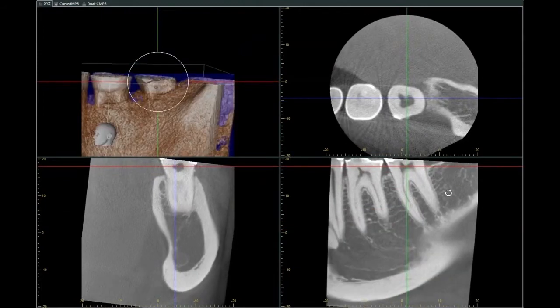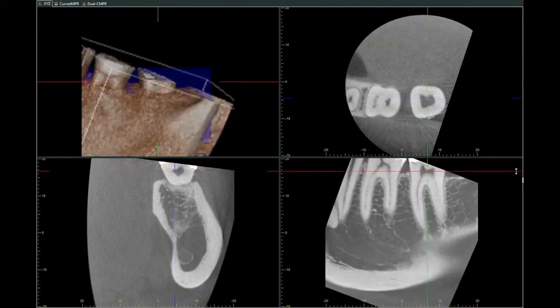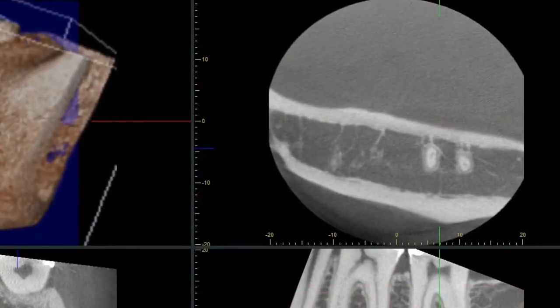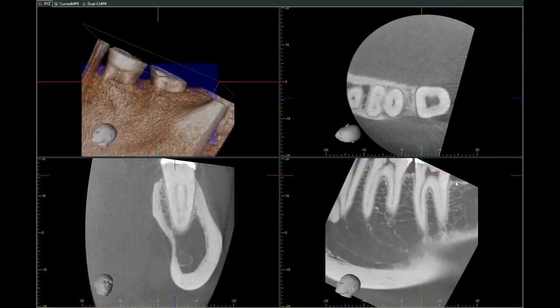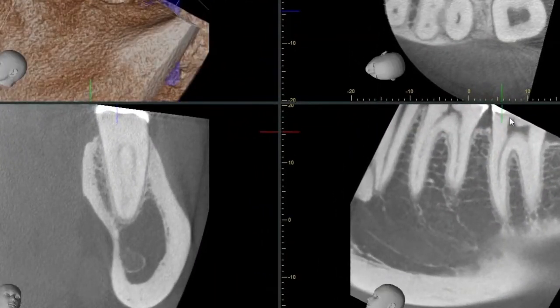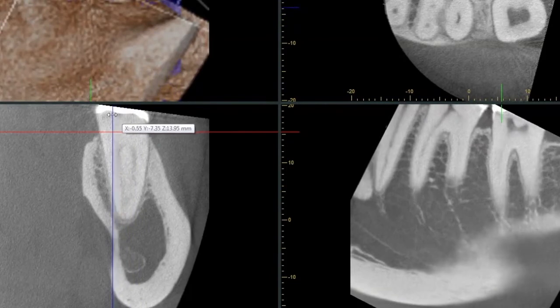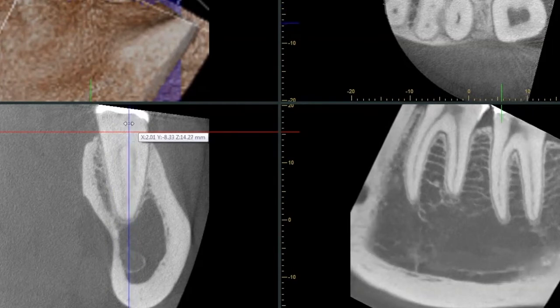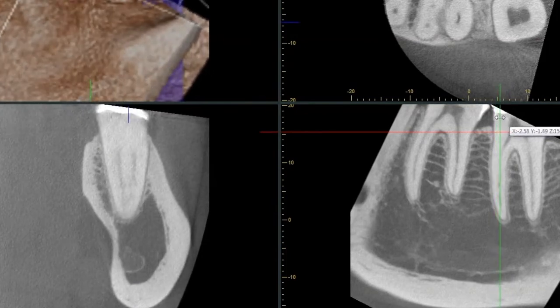I'll probably have a whole video on looking at CBCTs and interpretation, but I always like to look at the axial section first. You can see here we have two canals in the mesial and one canal on the distal. The two mesial canals tend to join in the apical third. Looking at the anatomy, you can see from the coronal section on the left side that we have some type of webbing going on towards the apical area, but the canals do join. From the sagittal section on the lower right, you can see the canals are fairly straightforward. You can also see the mental foramen in relation to the apical area, and the convergence of the roots from the coronal section.